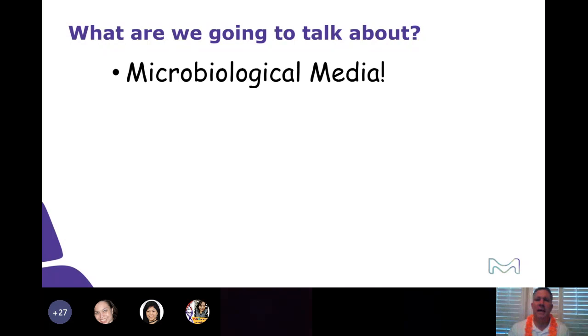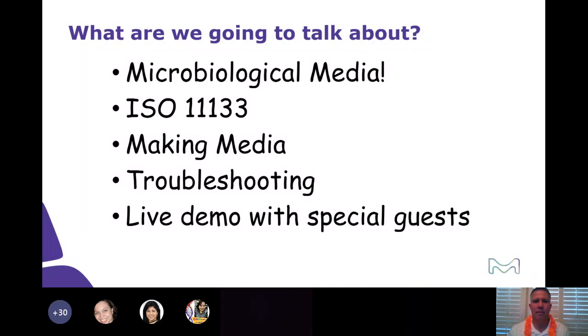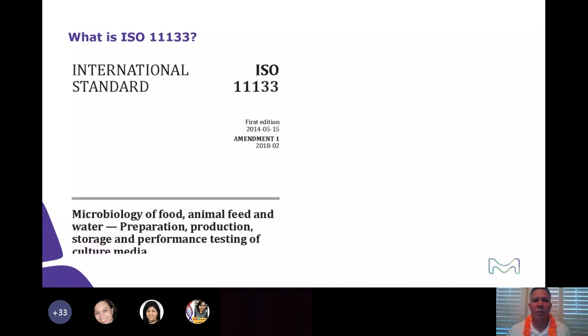So today we're going to talk about media. How can you do 30 minutes on media, you might ask? Well, we can do it even with a smile on our face. What is ISO 11133? Another ISO regulation that people probably don't know a ton about. Making media, not only how do we make it, but also how do you make it? And then some troubleshooting tips on what can go wrong. And then we have a live demo with a couple of special guests on media. Okay, let's get started. What is ISO 11133?